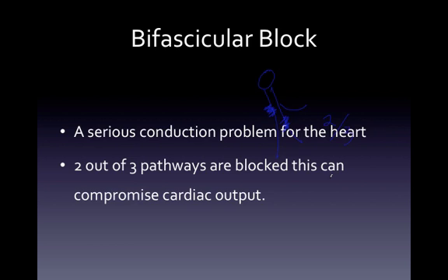If this person stands up, they can go, if you put more demand upon them, they can seriously go into 3rd degree heart block in your presence within a 6-second strip. So be very careful whenever you have a bifascicular block that these patients are essentially carried or assisted as much as you can.